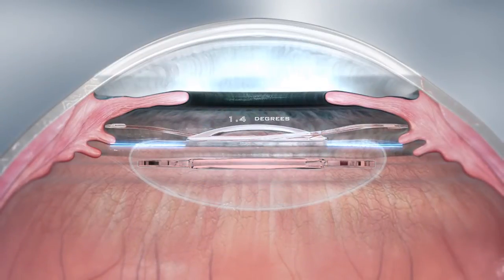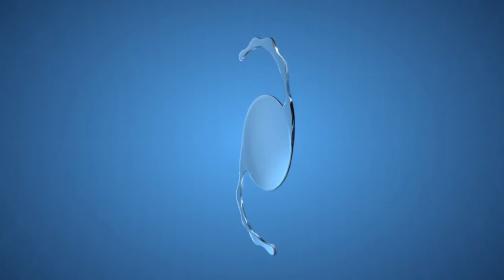Furthermore, the haptics have an angulation of 10 degrees to prevent iris chafe and pigment dispersion. A SulcoFlex IOL can duet with any primary implant.